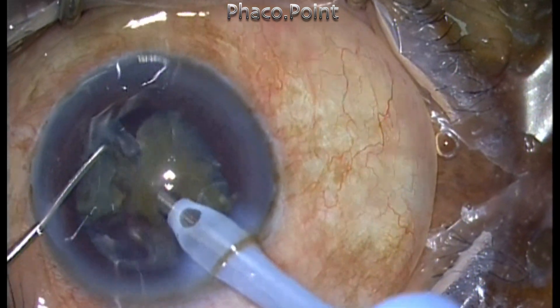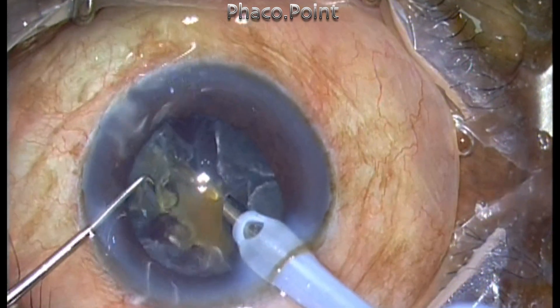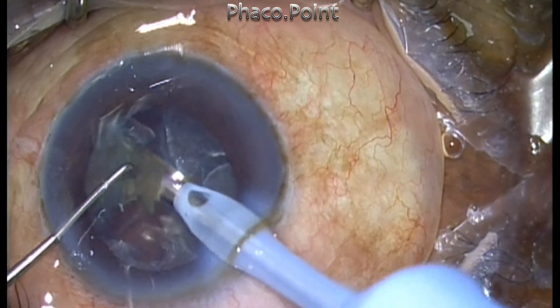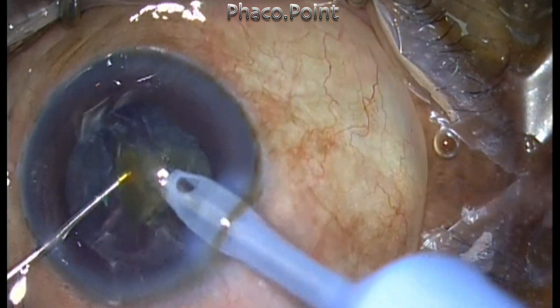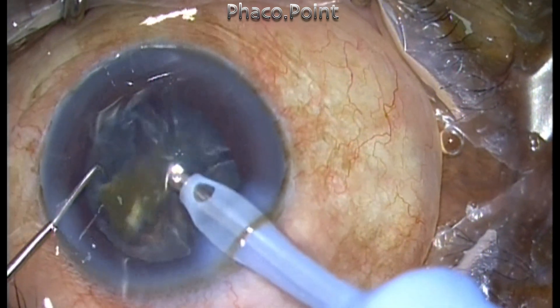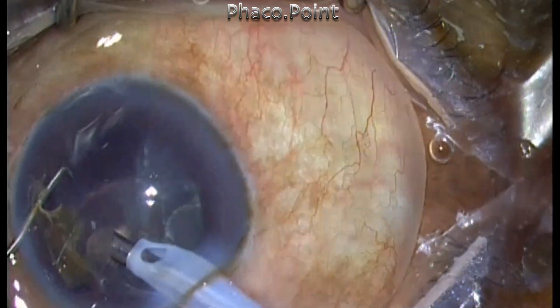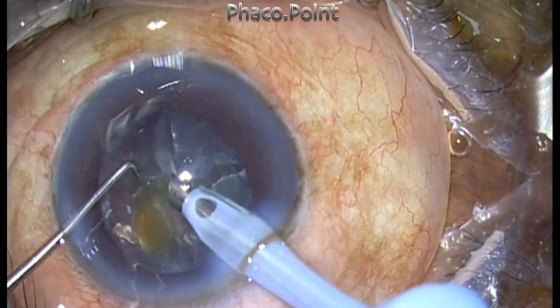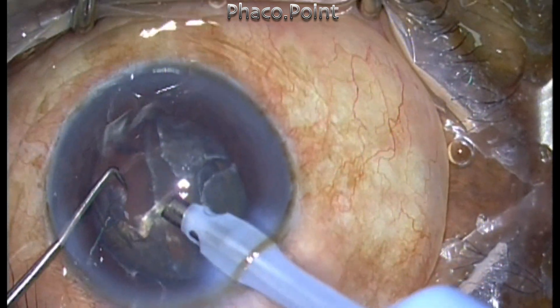The most important benefit of creating smaller fragments is better mobilization of nuclear fragments, a cleaner anterior segment, and fewer flying fragments hitting against the corneal endothelium and causing damage. You will end up with much, much clearer corneas on the post-operative day — unless you try this out, you simply won't believe the type of clarity you can get.